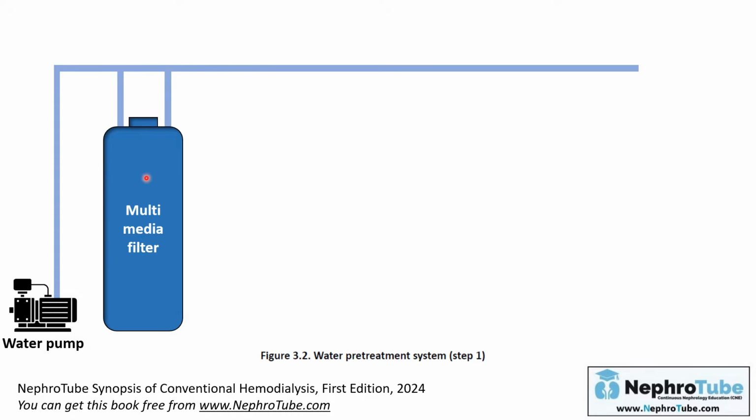But I have to mention first, in many centers, especially in areas where there is a possibility of losing the city tap water due to maintenance or whatever, most of these centers put at the start a primary tank to store water, to get a water supply in case the city tap water is lost due to any reason.